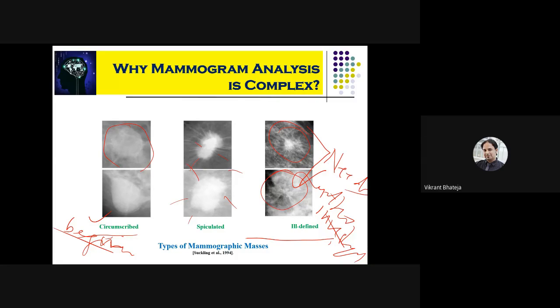So now this particular example will certainly give you very good food for thought, because in almost the maximum of the research being done on CAD approaches, people try to focus on just two types of abnormalities. That means ultimately your results are classified as either cancerous or non-cancerous, right?